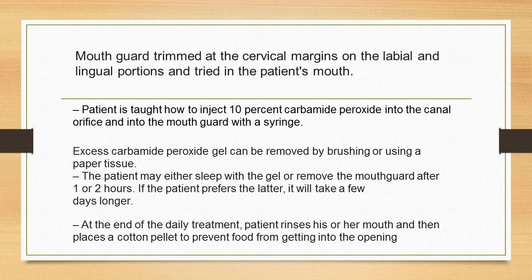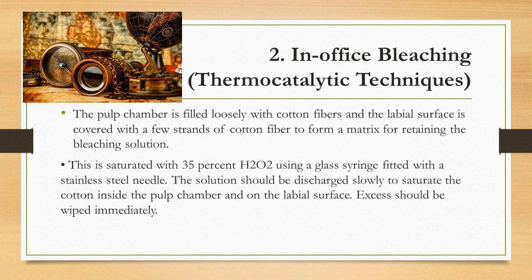The tooth should be bleached every day, not more than 3 to 4 sessions. After that, the patient can rinse his mouth. For the non-vital tooth, we also have in-office bleaching.